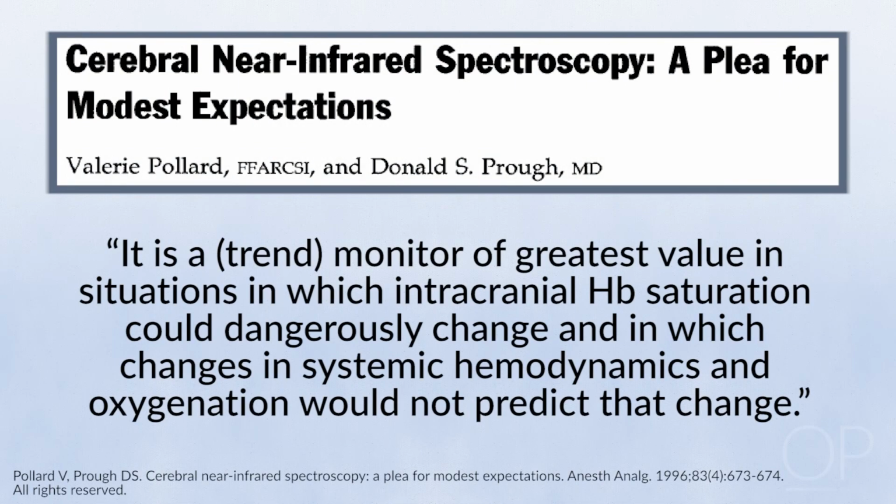I'd like to leave you with a quote from an editorial published in 1996 when the first commercial cerebral oximeter was approved by the FDA. I put the word trend in parentheses because I think trend is important, but range is also important. And as cited in the editorial, it is a trend monitor of greatest value in situations in which intracranial hemoglobin saturation could dangerously change, and in which changes in systemic hemodynamics and oxygenation would not predict that change.